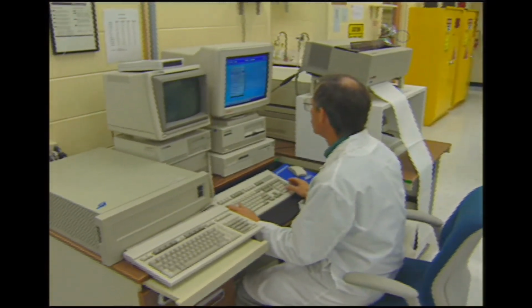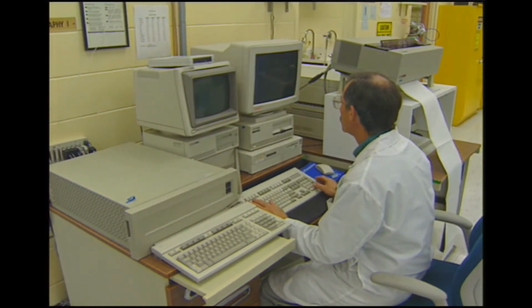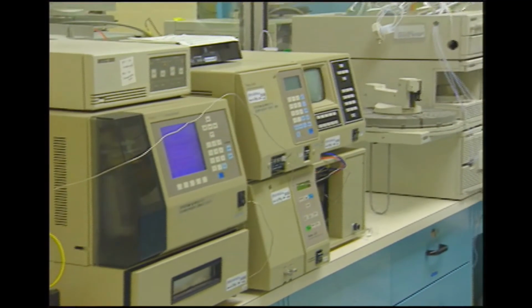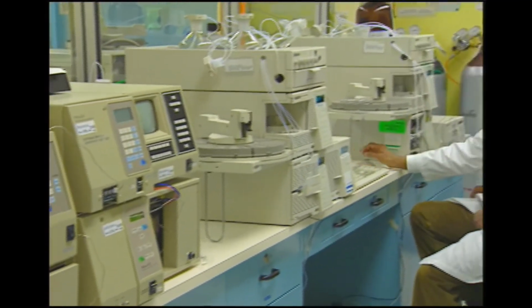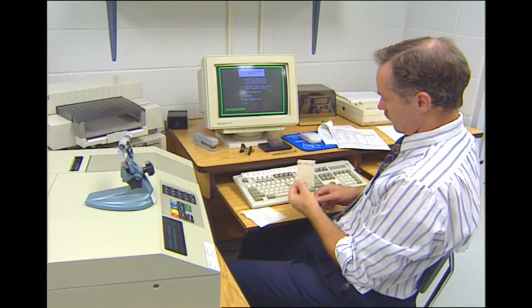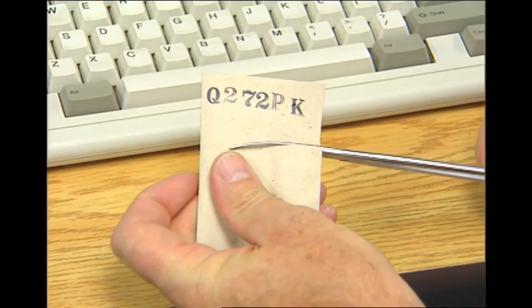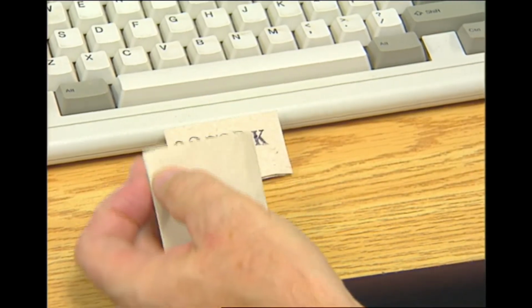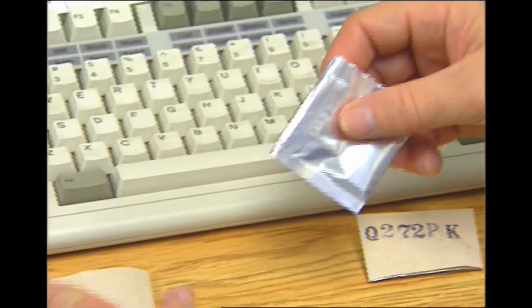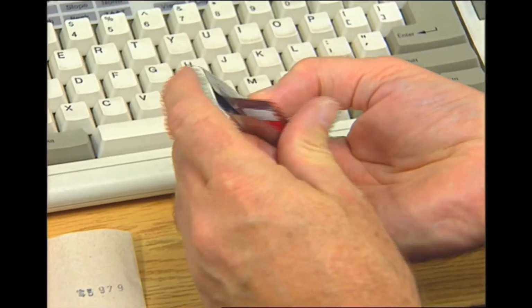Raw materials are subjected to extensive physical, chemical, and biocompatibility testing in order to ensure the safety and efficacy of the final product. Emission spectrographic analysis ensures that cylinders and wire meet the stringent requirements for purity. Accurate radiation dose mapping ensures that all GFO IUD products receive the correct radiation dose.